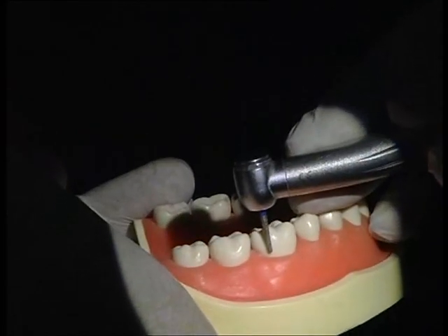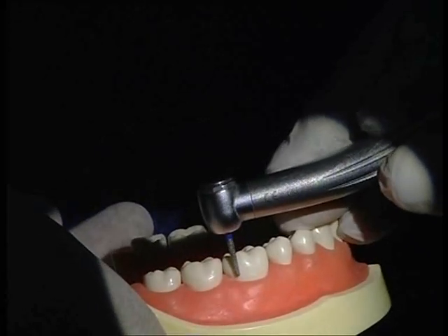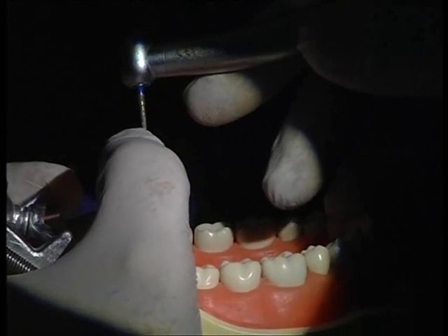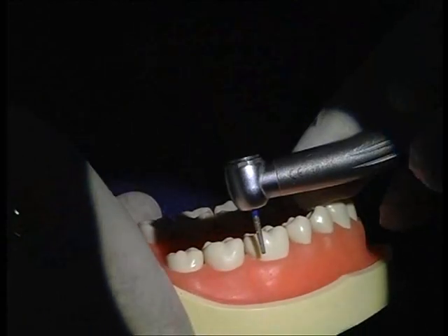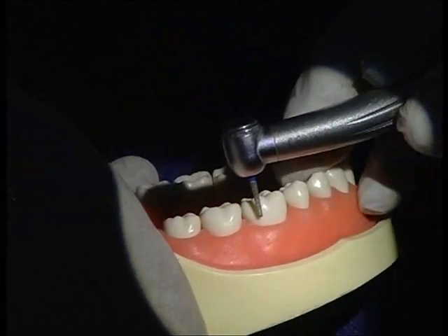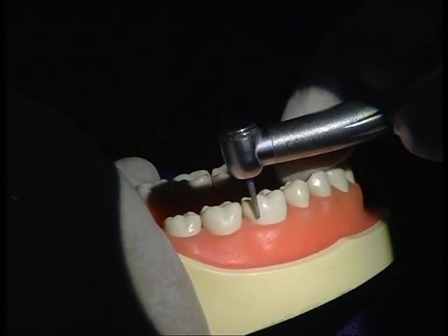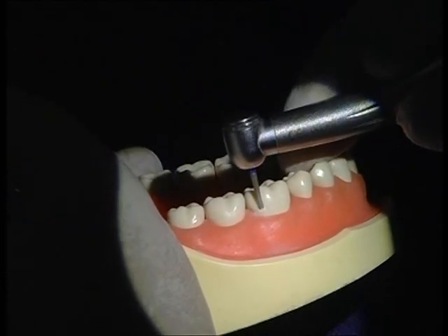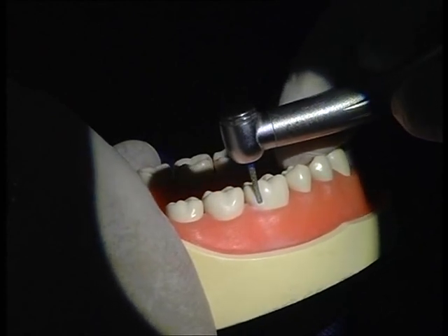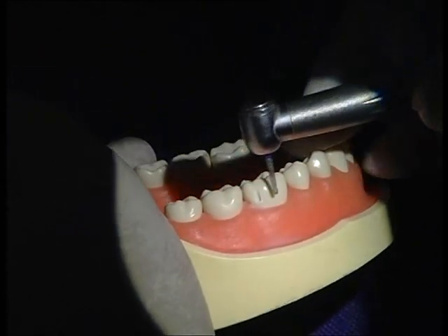I'm going to start with three depth grooves in the gingival plane only. First I want my tip to sink in completely. The diameter of the tip here is one millimeter, so when I sink in completely at the margin I automatically get one millimeter. Starting with plane one — appreciate that I've sunken in completely inside. This has to be straight; there's no change in this plane whatsoever.